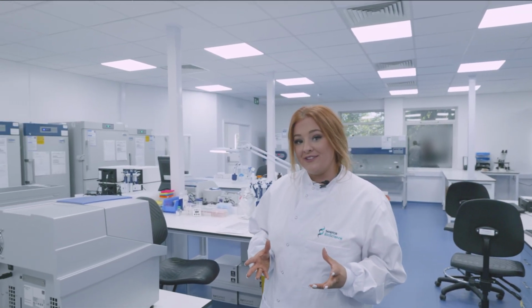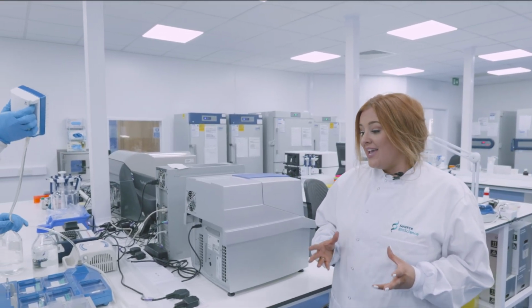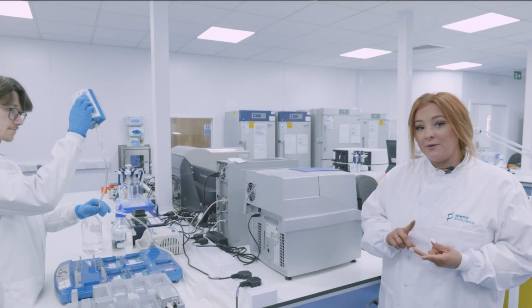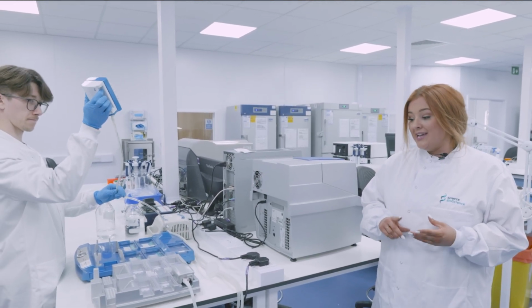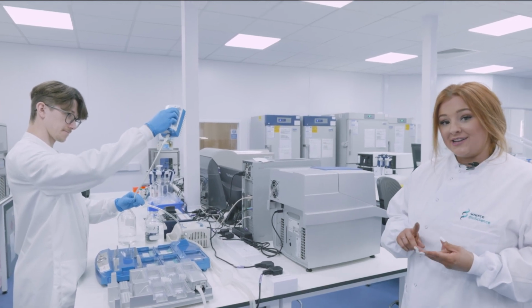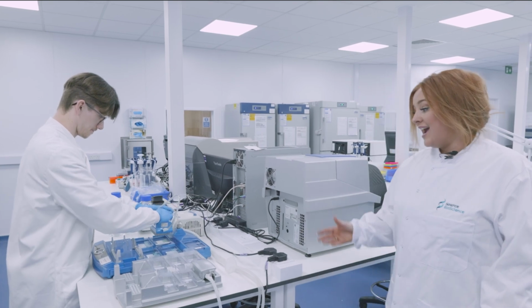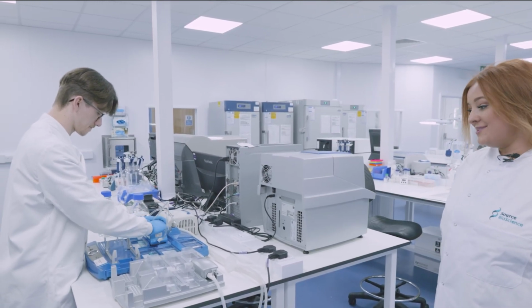And we're back in the main laboratory. This is where we do our sequencing, and we utilise pyrosequencing method. This is for our mutation analysis detection. This is for cancer types such as lung, melanoma, and colorectal. We test for KRAS, NRAS, and BRAF in colorectal, NRAS and BRAF in melanoma, and EGFR in lung cancer. As you can see, this is the method that we use.